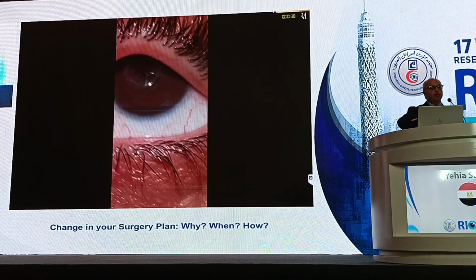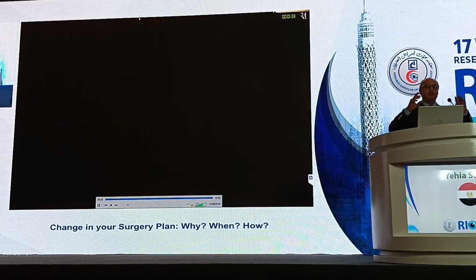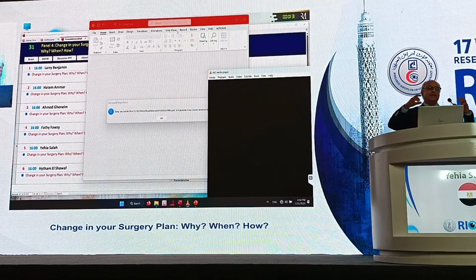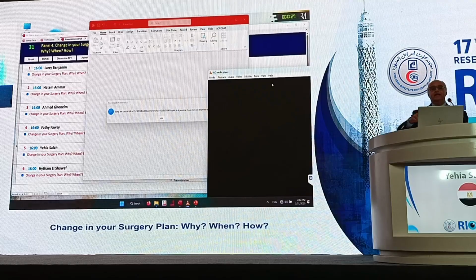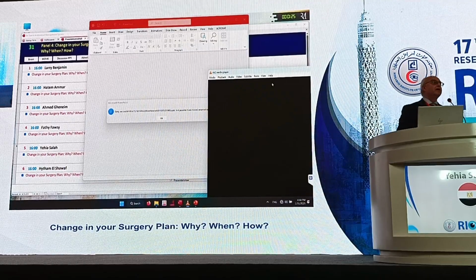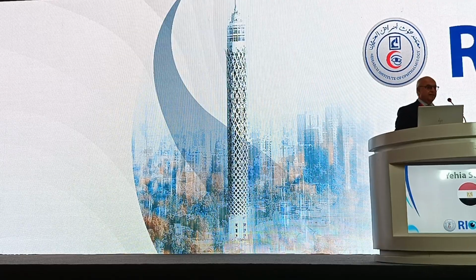The opening of the pupil is due to the presence of the haptics of the anterior chamber lens for a long time, and the synechiae. This stretches the pupil and sometimes can induce ischemia in areas, and this is a well-known phenomenon we know from anterior chamber lenses in general, whether phakic or aphakic.